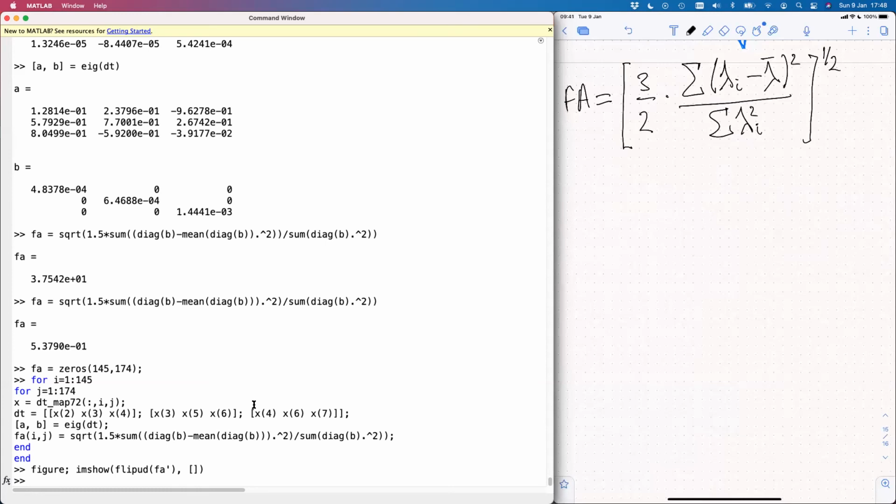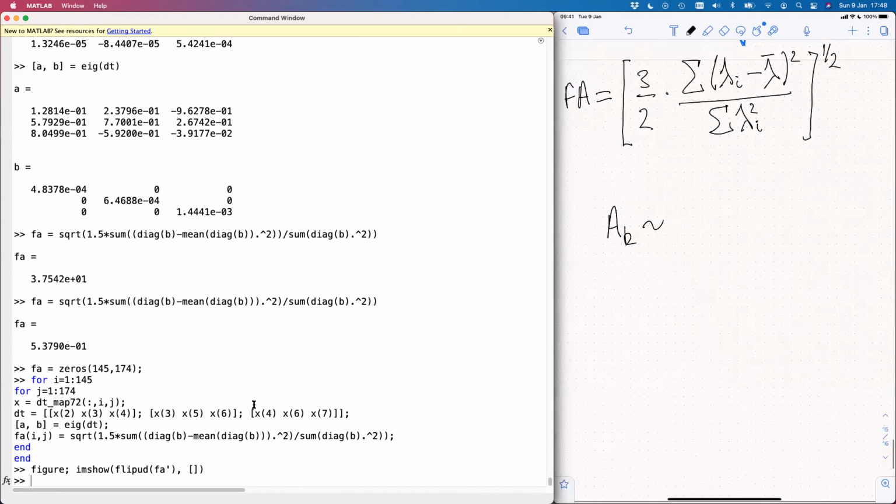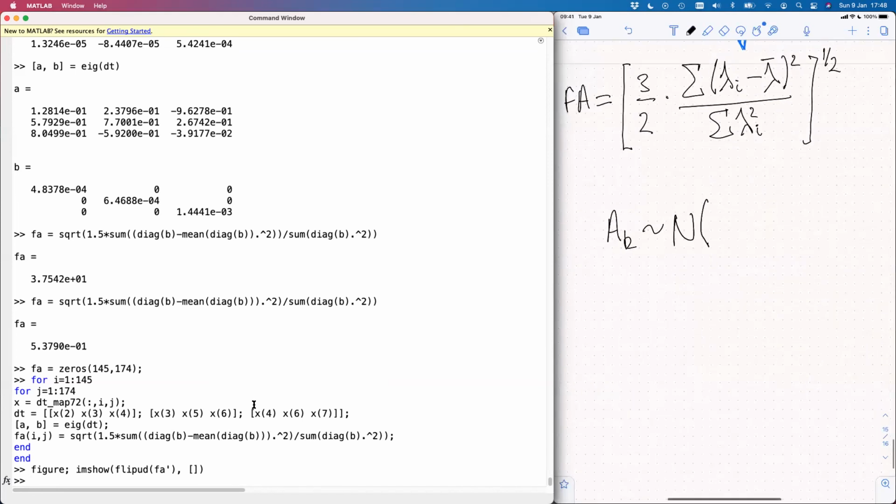So it's actually not an unreasonable assumption that each measurement we make, let's call it AK, follows a Gaussian distribution around a true corresponding signal, SK, with standard deviation sigma that does not depend on k.